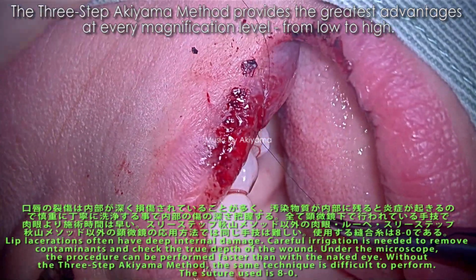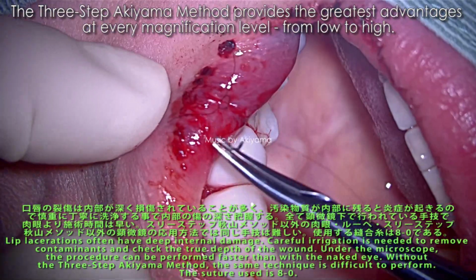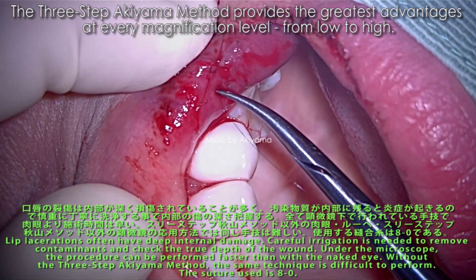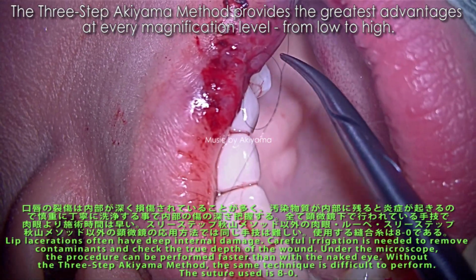Lip lacerations often have deep internal damage. Careful irrigation is needed to remove contaminants and check the true depth of the wound. Under the microscope, the procedure can be performed faster than with the naked eye. Without the three-step Akiyama method, the same technique is difficult to perform. The suture used is 8-0.